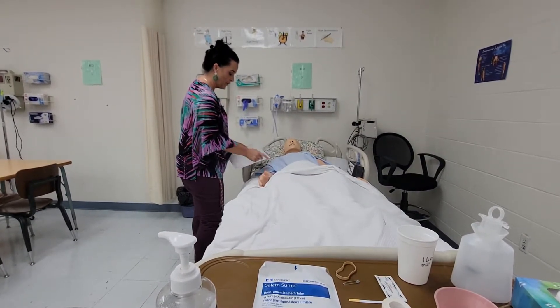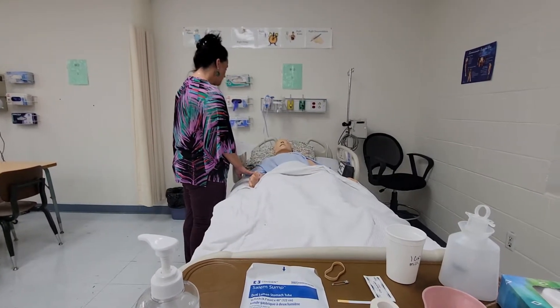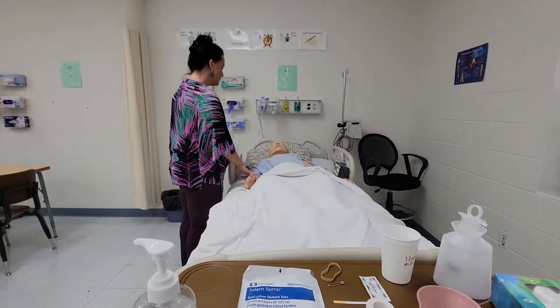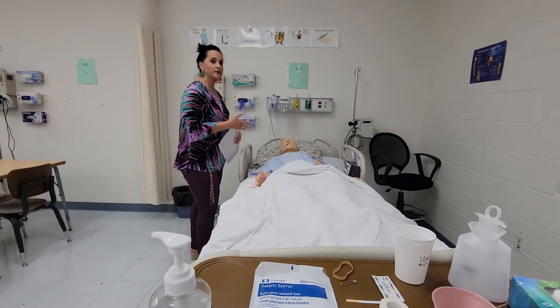We go over their date of birth, we go over their allergies — you have no known drug allergies. Is there anything else you can think of that you might be allergic to? They say no. Now I'm going to explain to them what we're going to be doing.